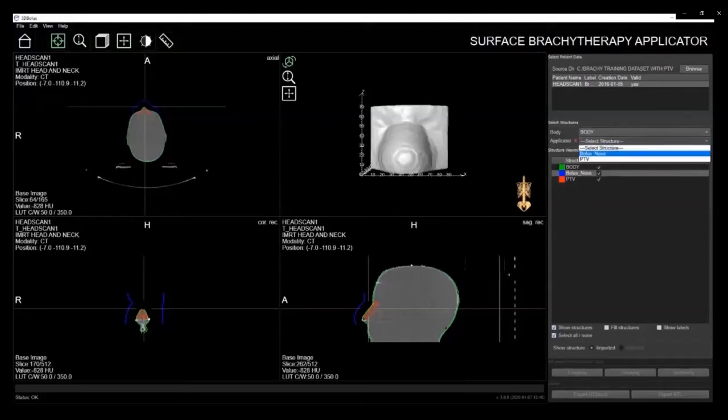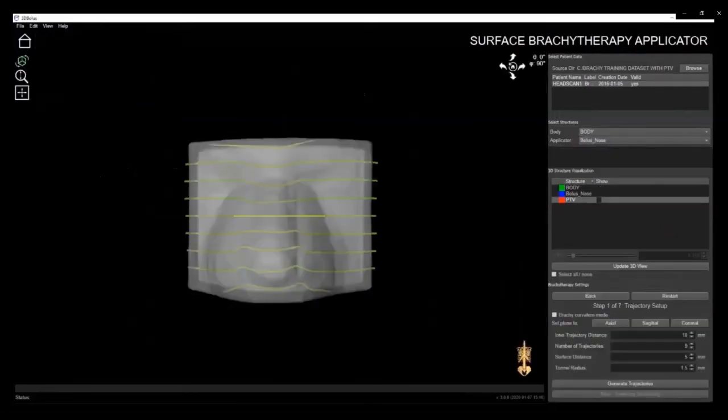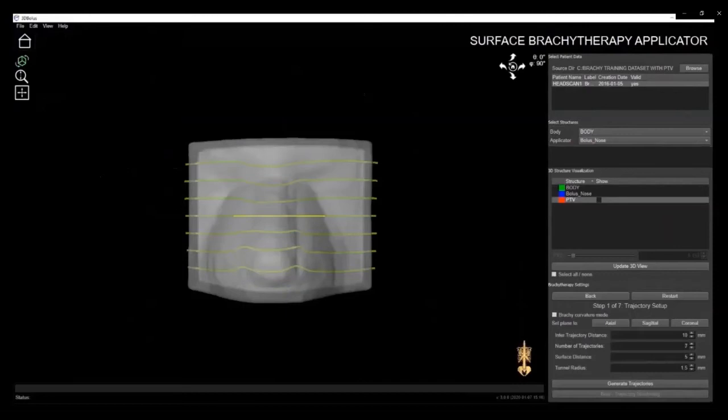The software's available features allow you to select how many catheters you require and the uniform distance between each catheter. You can easily specify the surface distance as well as change the orientation. And finally, you can manually change the tunnel radius depending on the catheter size you are using.